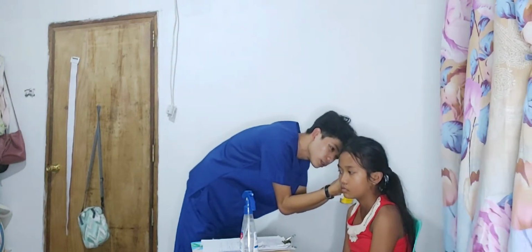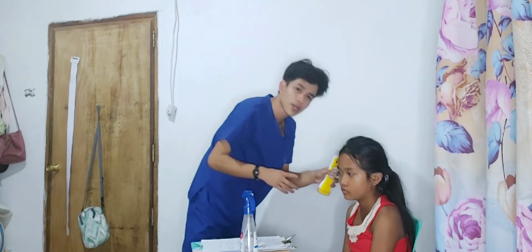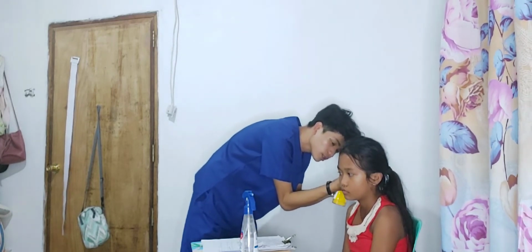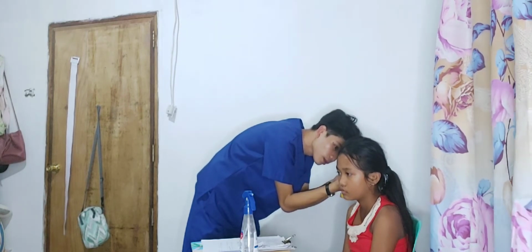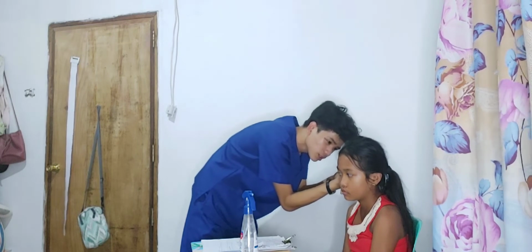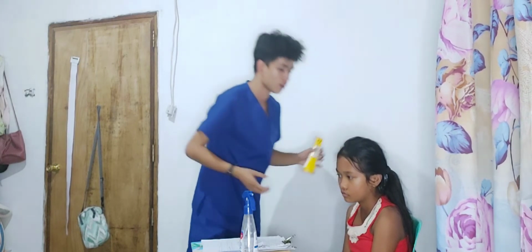So observe also and inspect for the tympanic membrane. So check for any size, color, and consistency or discoloration. Okay.